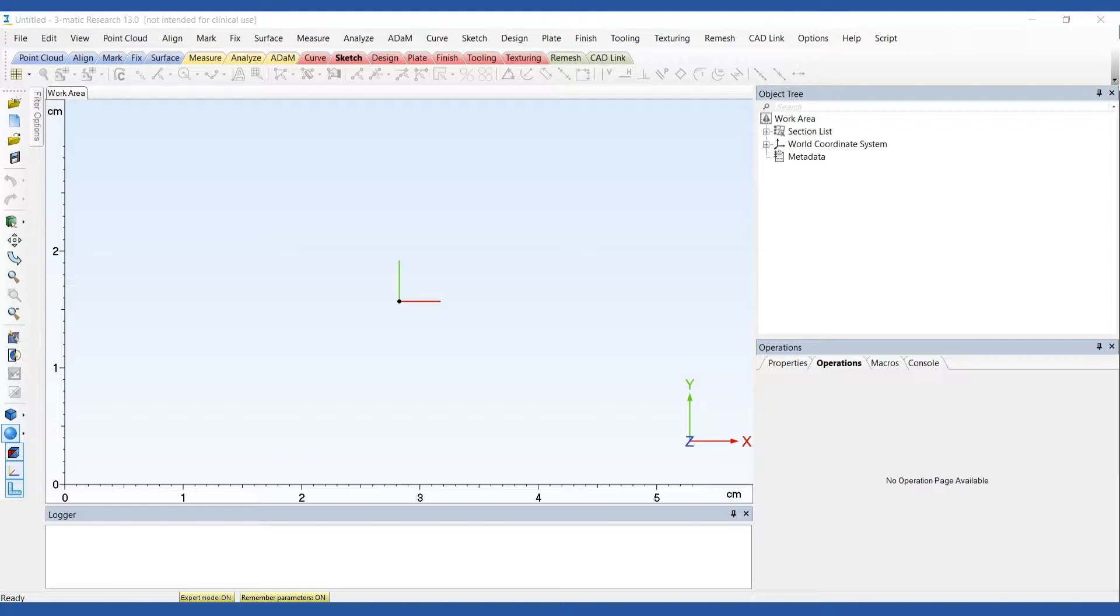These models are helpful for evaluating stent placement, conducting flow studies and much more. This video is going to show you how to create a customized benchtop model based on a cardiovascular image file.